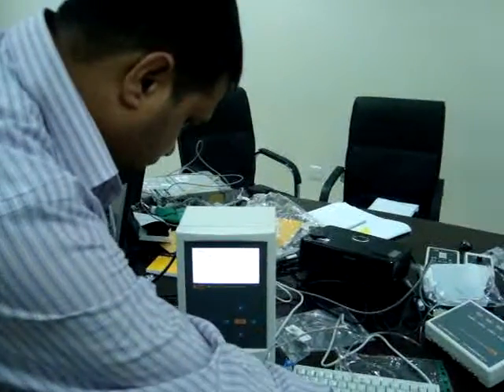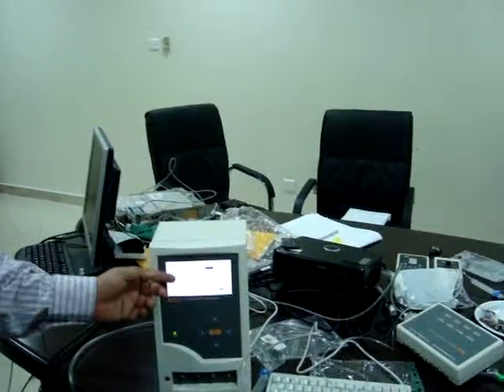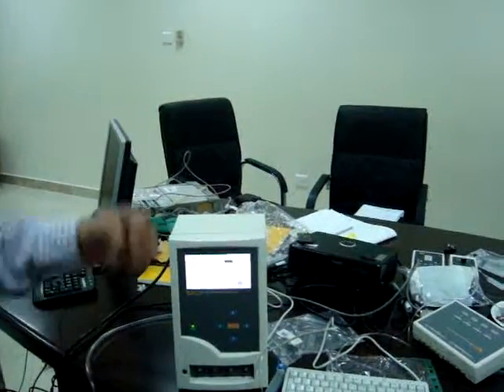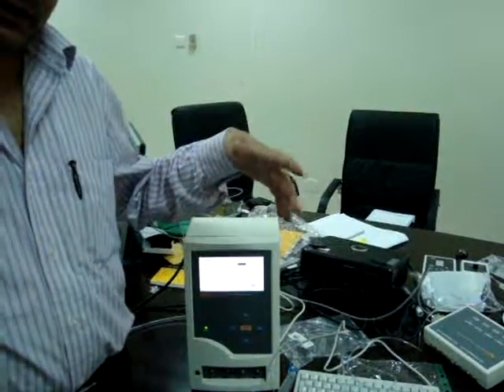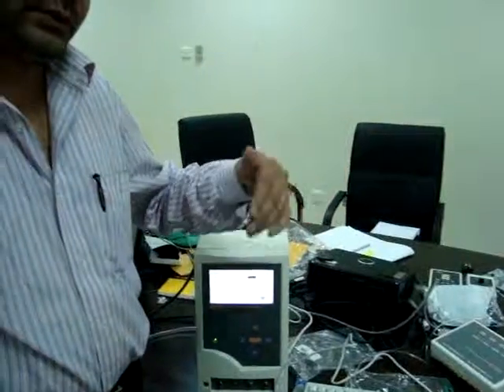Then we have the level flow: secondary rate, secondary volume, primary rate, primary volume. What's the difference between primary and secondary? Primary is the main medication when you are giving, and secondary is when you are just maintaining the port open, so you set some rate and leave it.